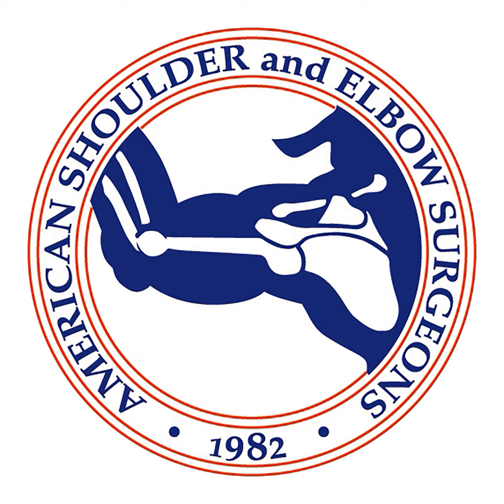I know it's not maybe the most common case, but when you do this case, you both mentioned that you are repairing the tendon at the medial aspect of the footprint, maybe medializing a little bit, and then putting the patch over the top. So maybe we could start with you, Peter Millett. When you do that, are you putting separate sutures in the cuff medial to your anchors? Are you passing the sutures from the anchor through the patch? Are you putting more sutures at the lateral aspect of the patch, or are you just putting the sutures over the patch? Tell us a little bit about your technique for that case.